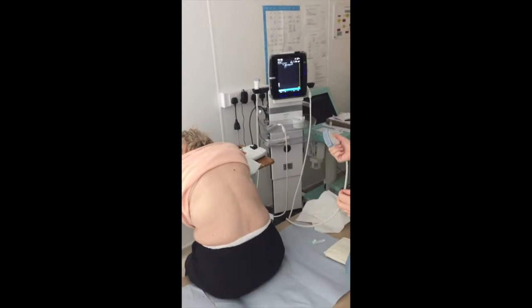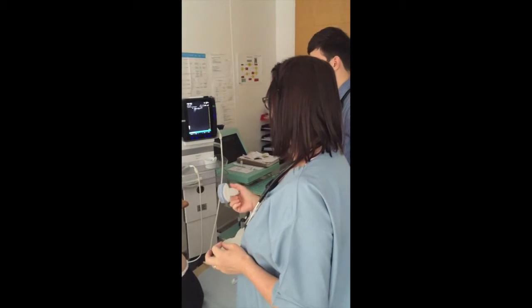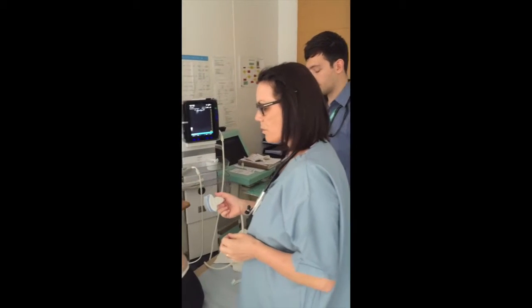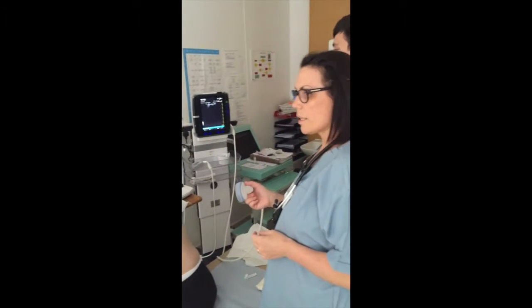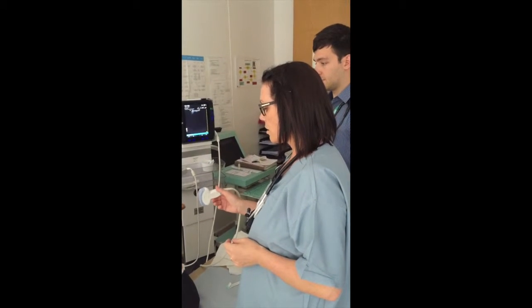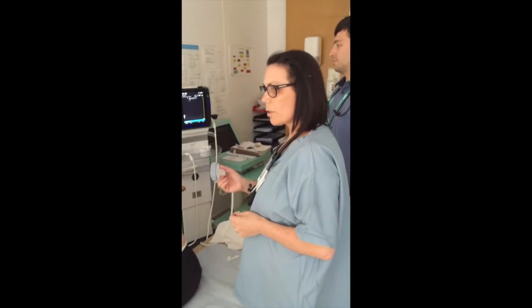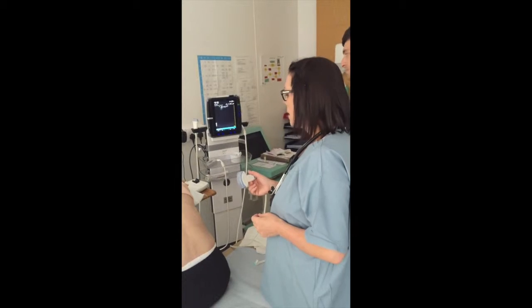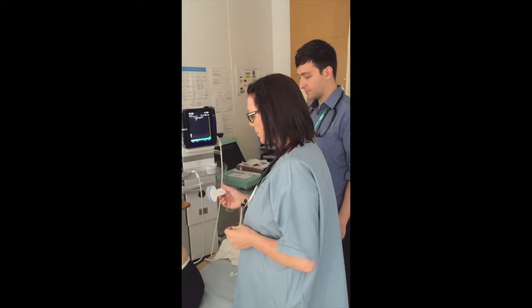Okay, so what we're going to do first is just do an ultrasound scan of this lady's chest before we do a pleural aspiration. On the CT, she's got a large pleural collection, and what we want to do is take a diagnostic therapeutic pleural aspiration today, but we're going to use ultrasound marking. Probably what she'll need to have done after that is a medical thoracoscopy.